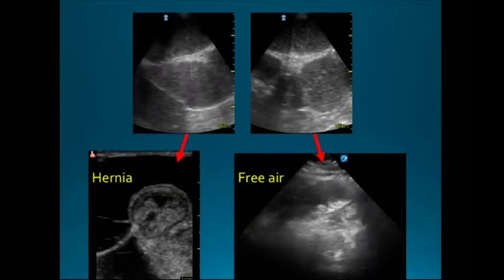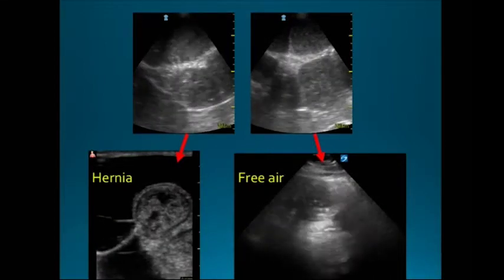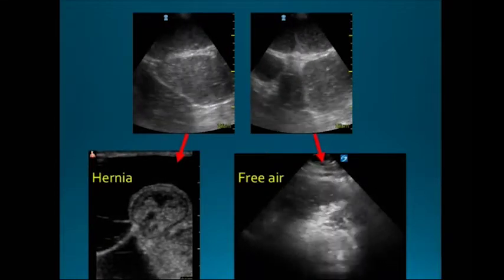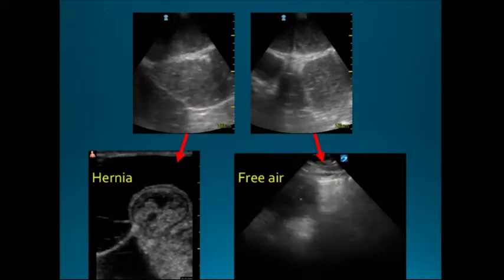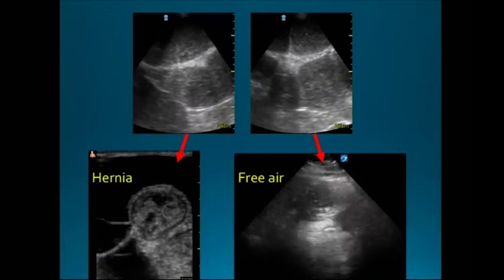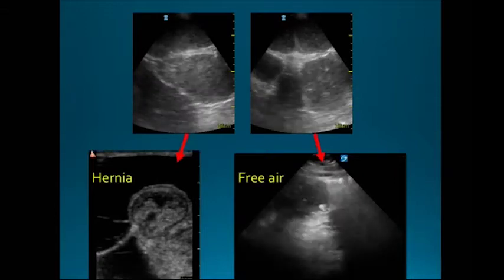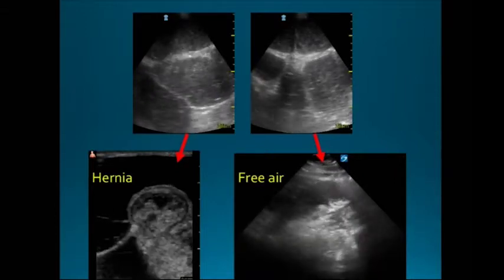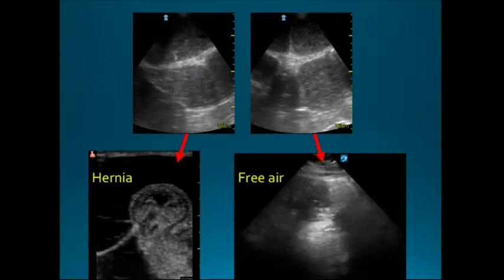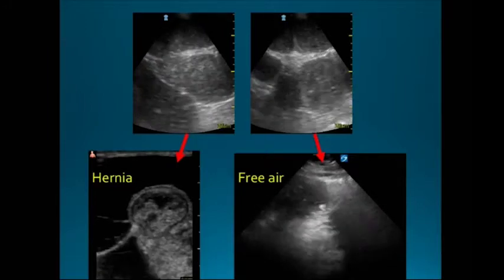So in this case, you can see their incarcerated hernia, and you can also monitor them over time for the development of complications. This is a person who was seen by the surgeons, and they just wanted to do conservative therapy over time. And then he developed an acute decompensation, got very sick very fast, needed to be intubated. He had perforation. And you can see this kind of looks like lung, doesn't it? Doesn't it look like that lung point that I showed you earlier? But this is air inside his abdomen, kind of wiggling back and forth there.